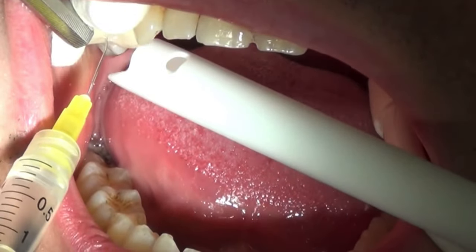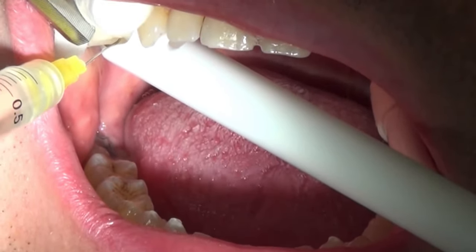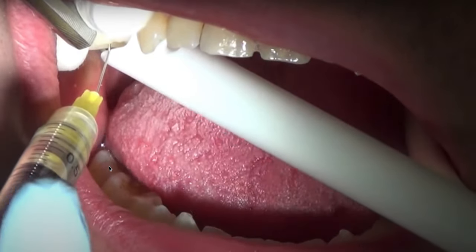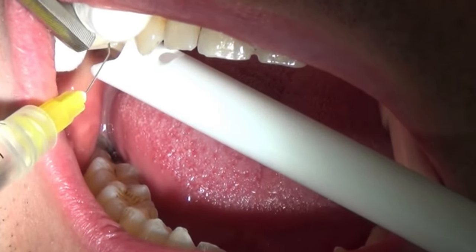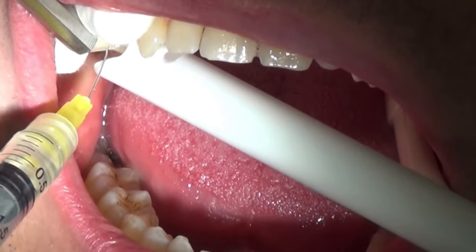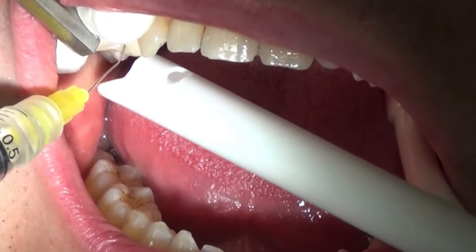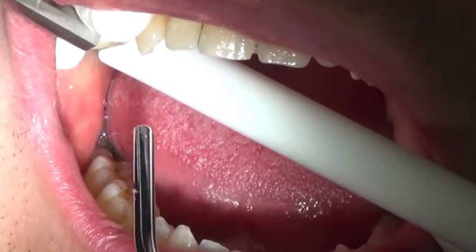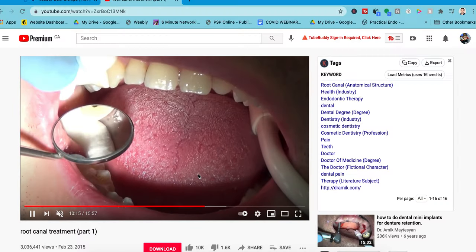We're irrigating with bleach — full strength for vital teeth, half or one percent for non-vital. There's literature to support that. Regardless, you don't want bleach in the patient's mouth. In the comments, someone said North Americans use rubber dam and rightly so. The counter-argument was that for a pulpectomy the rubber dam would only be used for the final endo visit, but in my mind — why not just put the rubber dam on for the whole thing? It speeds everything up and prevents irrigant getting into the patient's mouth.